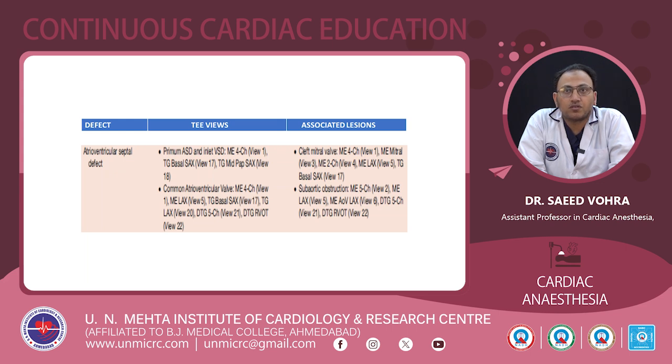Subaortic obstructions can be seen in the mid-esophageal five-chamber view, mid-esophageal long axis view and aortic valve long axis view.